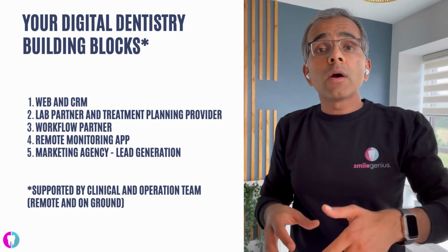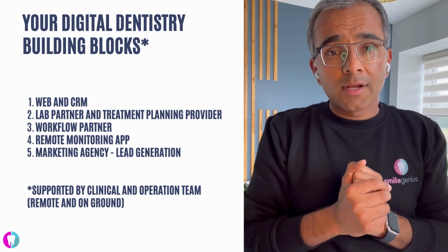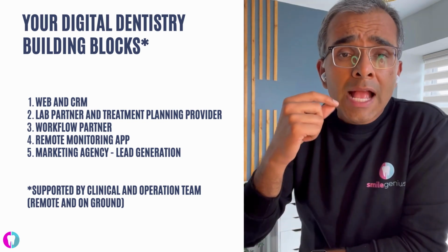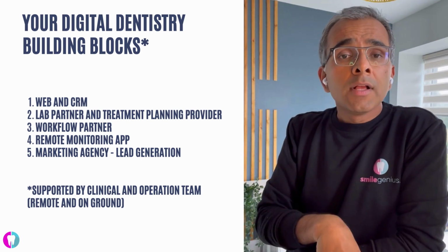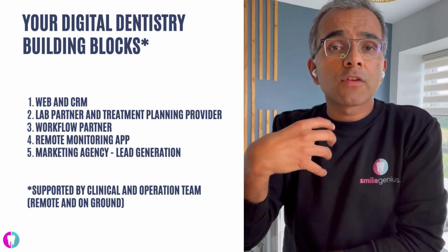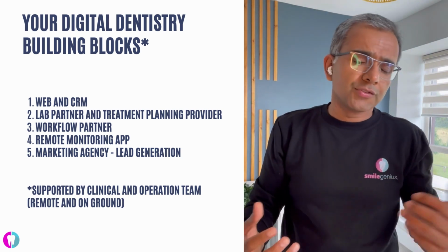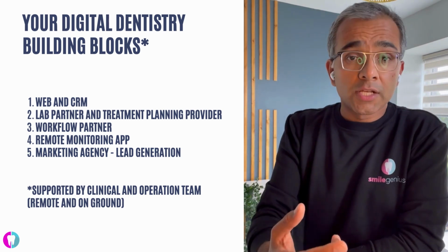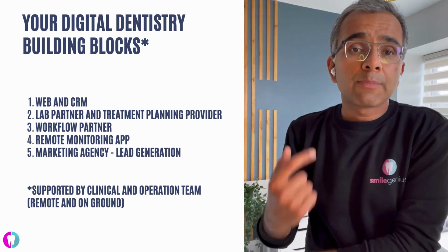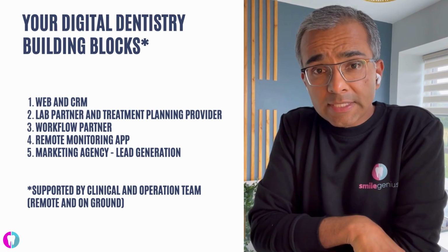So let's say if you are a direct-to-consumer business, it's a must for you, as a remote company or a teledentistry company. So having a remote monitoring app, which is the most common and easy to use platform for the patients, having an app rather than using a web, is something that you should be considering. Building it in-house is one way, partnering with other tech providers is another way, but make sure that, if you are a direct-to-consumer business, that's a must-have.